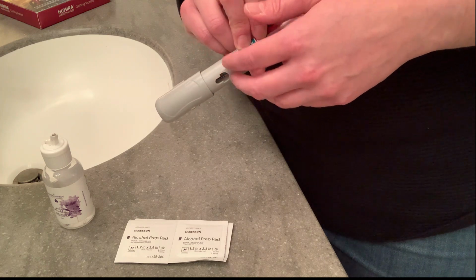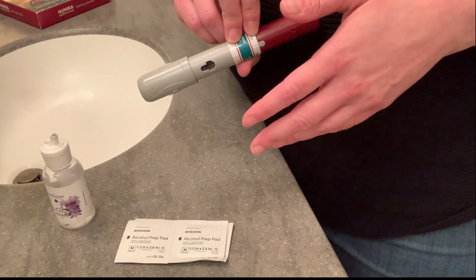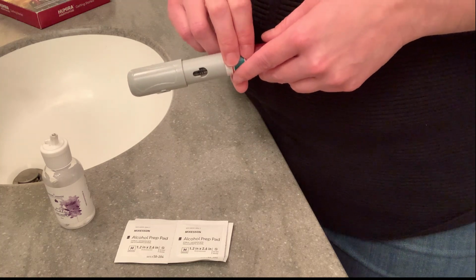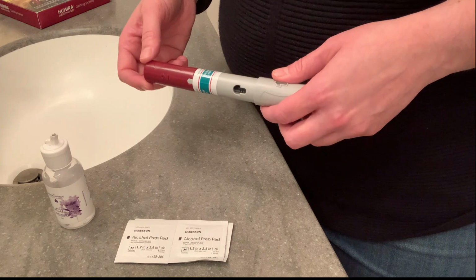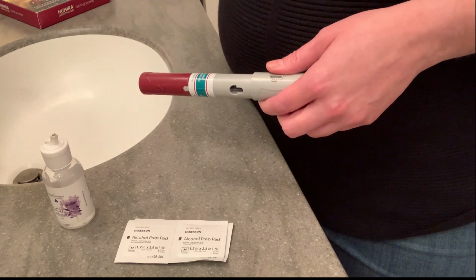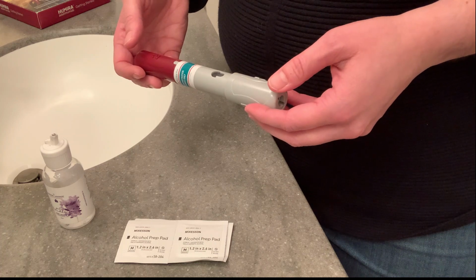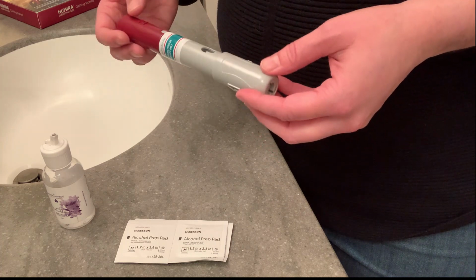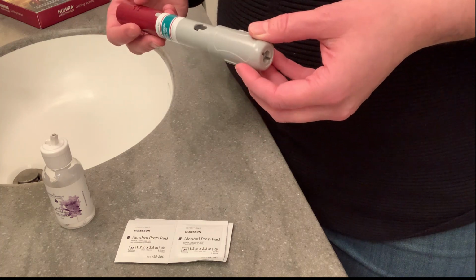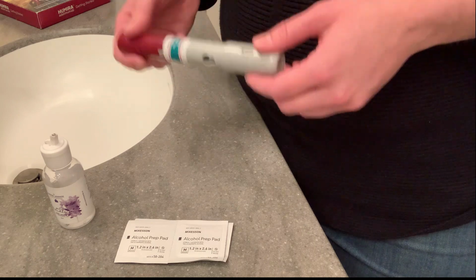But if it's really cloudy or you see some precipitates, that's not normal, and you should not inject when that's there. Simply contact either the pharmacy, manufacturer, or your doctor so that they can send you a replacement pen. So if everything is fine, then you can go ahead and proceed with the injection. Now, if you have an infection, it's important not to inject.